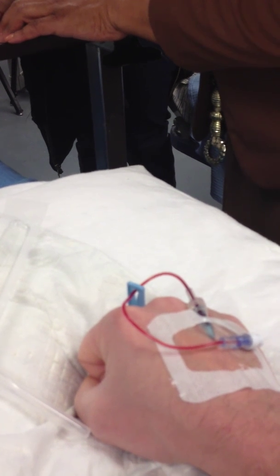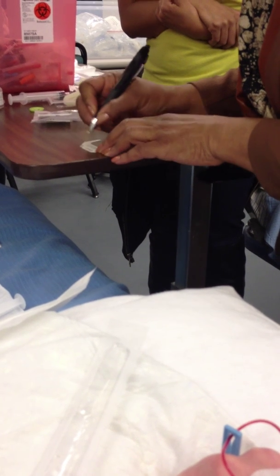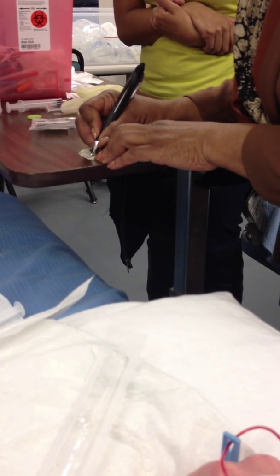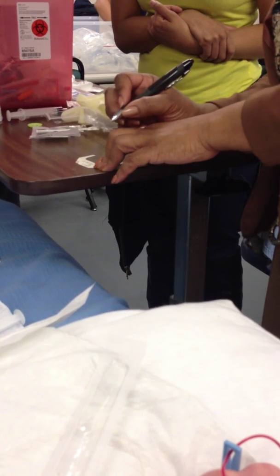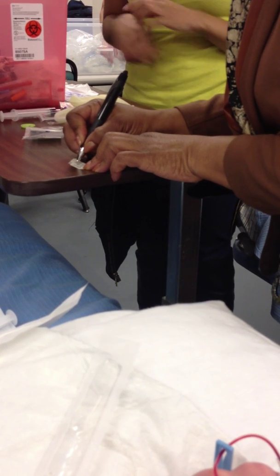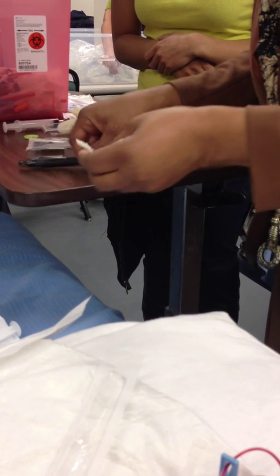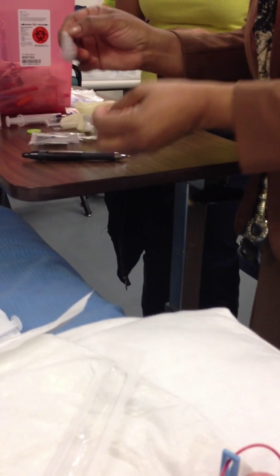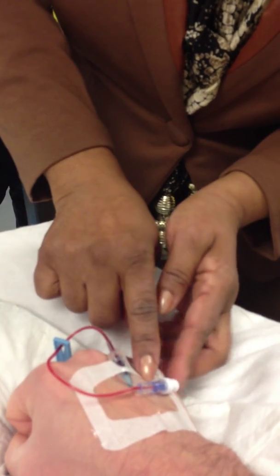Today's date: I put 1/15/13, and I used a 21-gauge. And this is an angio — or I think it is an Insyte catheter. And then I put my initials there. I'm going to put this right above his site here. Now you can hook him up, and I'll start his IV side.